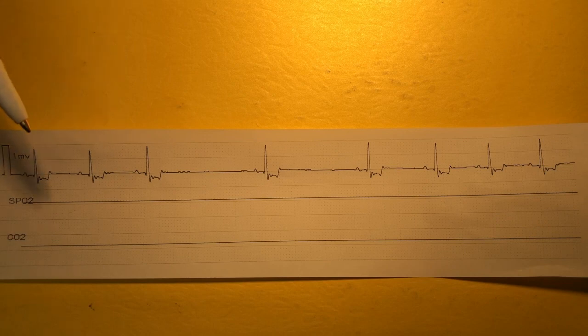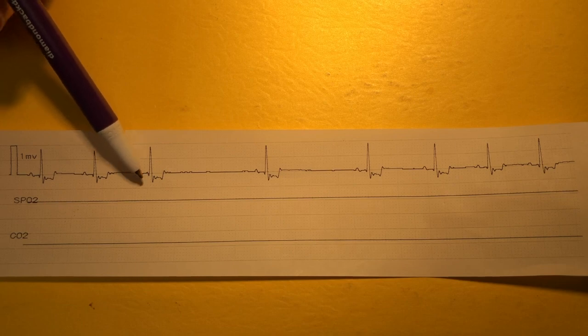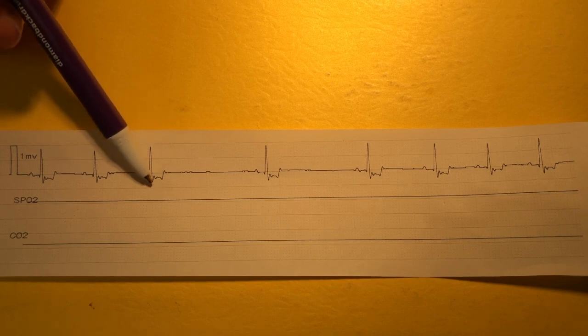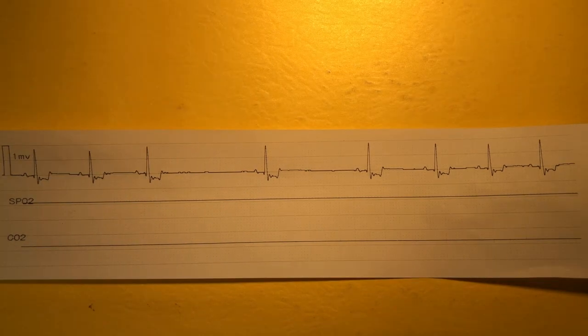But for Austin, we do have a P wave, which is this little bump here in front. Our Q is here, R, and an S. So we can see that evident throughout all of our complexes. As we look at our QRS complexes, we want to know if they are supraventricular or ventricular in appearance. Supraventricular complexes arise from above the ventricles, meaning our impulse comes from our sinus or AV nodes, or it comes from the atria, which is utilizing the rapid and normal conducting pathways in our heart.